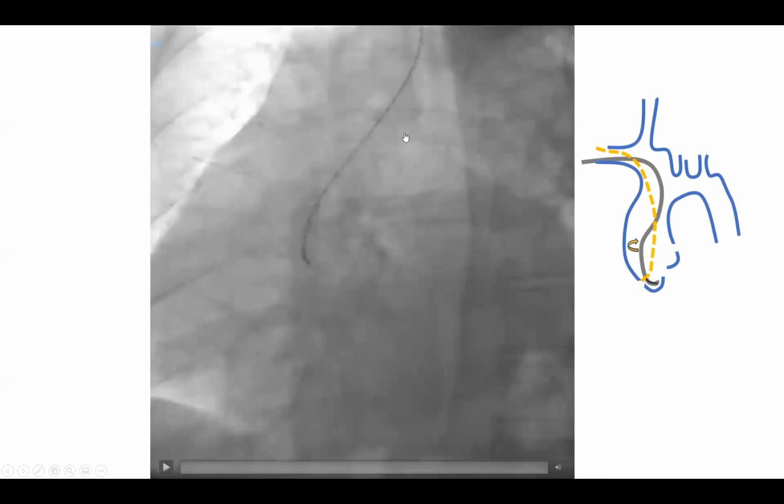So in a patient with innominate tortuosity, subclavian tortuosity, or a sharp innominate aortic angle, it is hard to transmit that tortuosity, particularly when you have that sharp and calcified angle. There will be some inability to transmit any of the clockwise torque for RCA engagement, okay? So this is such a patient where we were not able to transmit any torque to engage the RCA. So here is what you did.